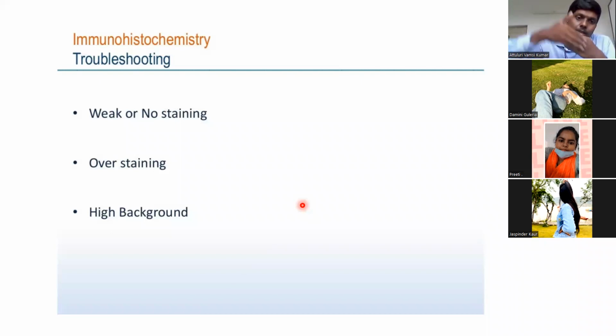Maybe those enzymes are cross-reacting with our staining enzymes, and they are overstained. Endogenous enzymes give color, and that might be the reason for overstaining. Okay, so if that is the reason, then what should I do? I need to subject this tissue again to an enzyme blocking reagent. I need to incubate this in enzyme blockers before I go for staining.